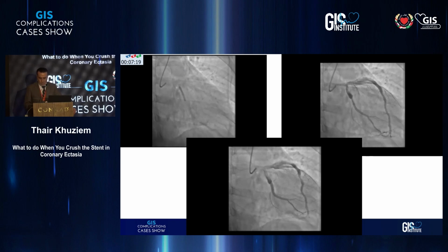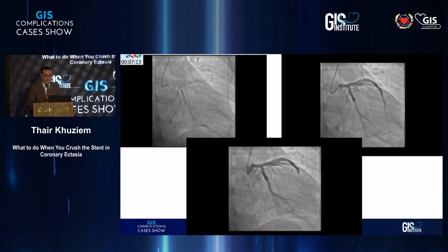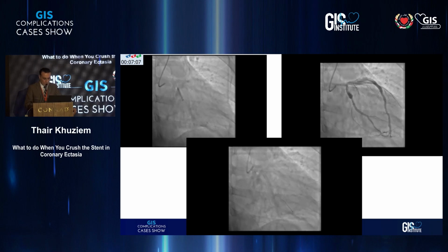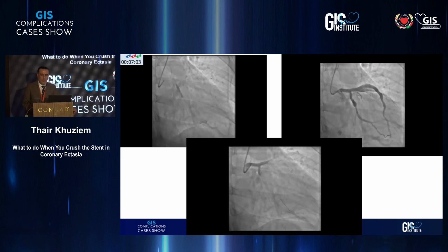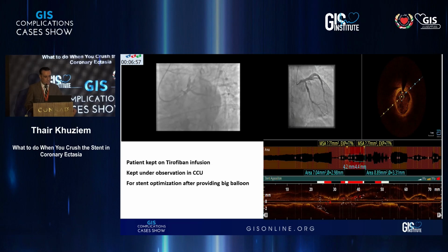So if you look down to the last image here, the result probably acceptable for us at that time, at least angiographically. And the patient had some improvement of the chest pain, and blood pressure started to improve after we deployed the stent. But we know that probably the stent in the ectatic or aneurysmal area is under-expanded or malapposed. So I decided to repeat the OCT.